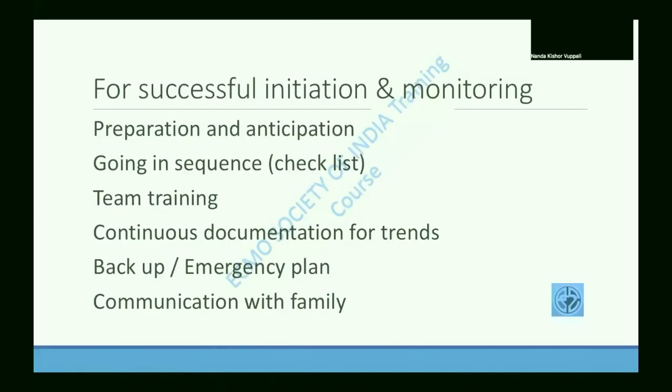So to conclude, for successful initiation and monitoring, a lot of it comes down to how much you prepared and anticipated the problem, so that you can mitigate these problems even before they arise. And going in sequence always helps, and having a checklist so that not even one step is missed is quite useful. And team training is quite an essential part of that, because many people are involved in ECMO initiation, not just a doctor. There are going to be doctors, nurses, perfusionists, respiratory therapists. So we need to have coordinated teamwork for that.